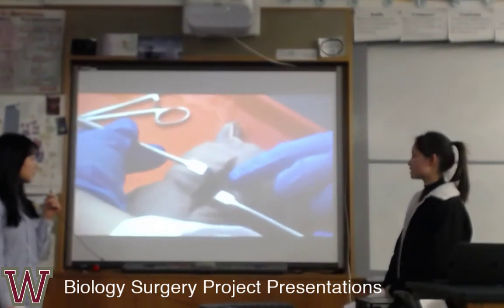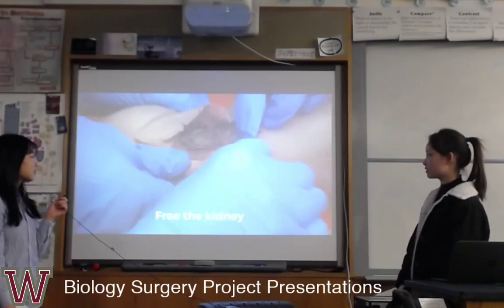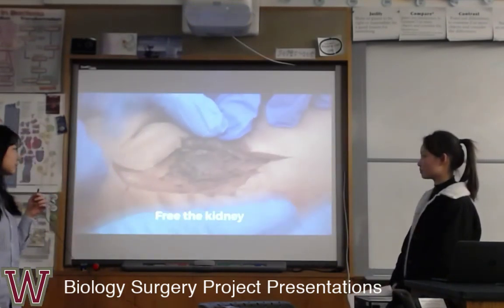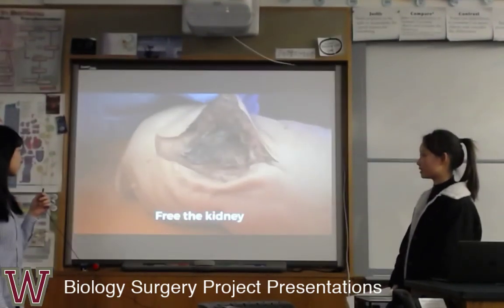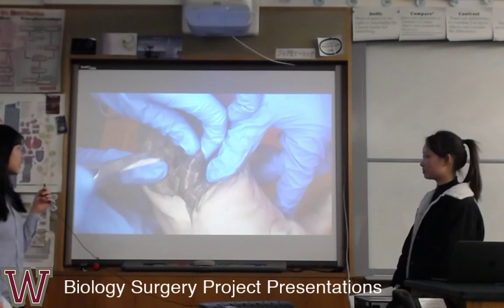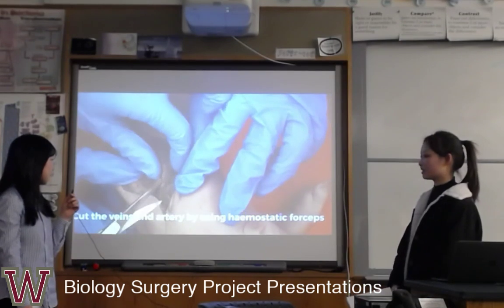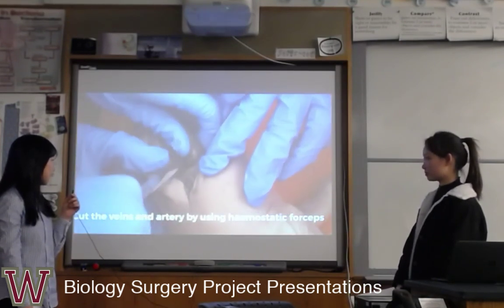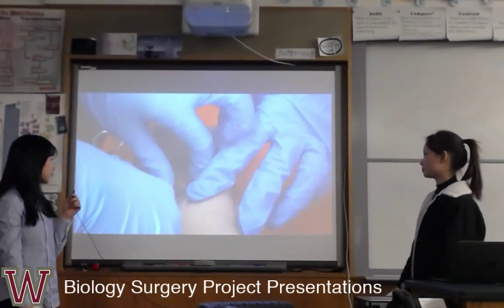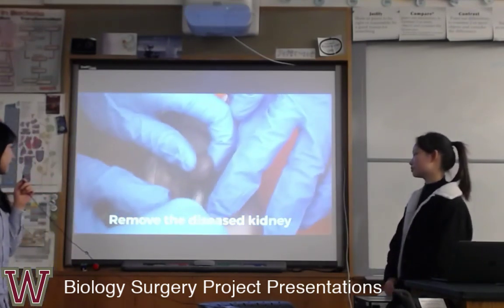So basically we see the kidney already and are ready to take it out. Here we are doing the process of freeing the kidney. Here we are cutting off the veins and vessels. And now we remove the diseased kidney from the patient's body.